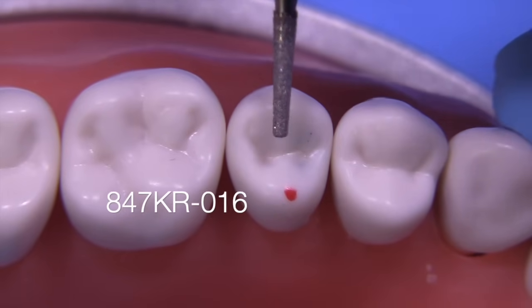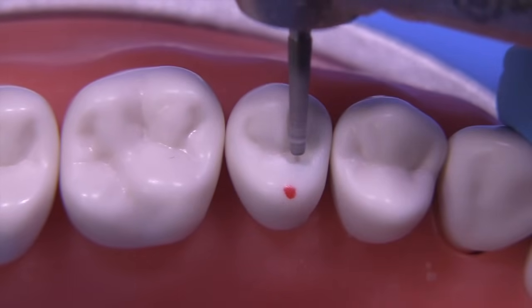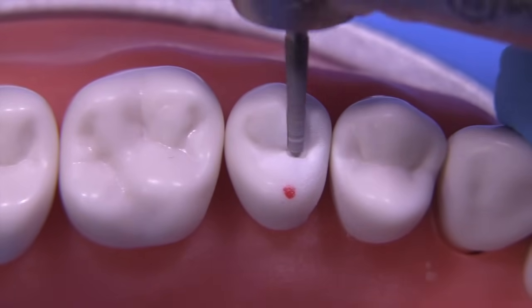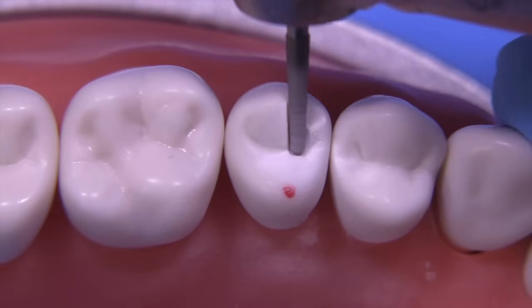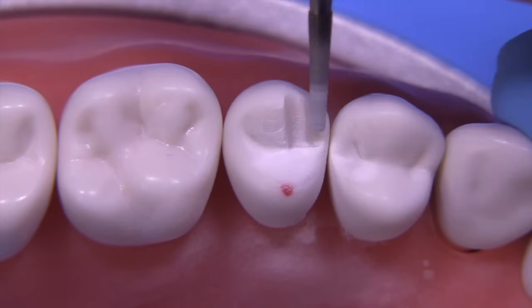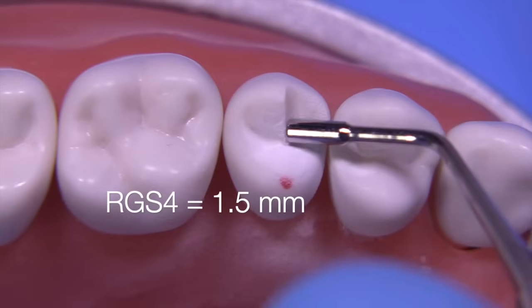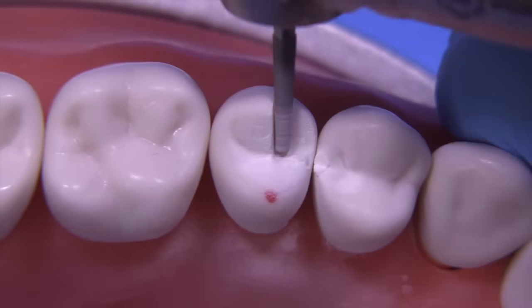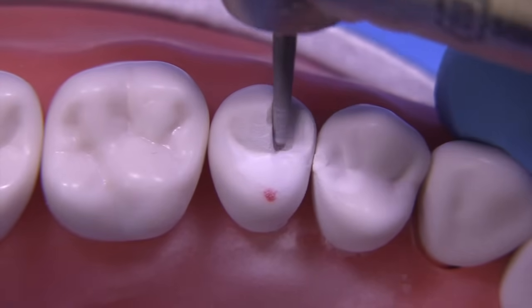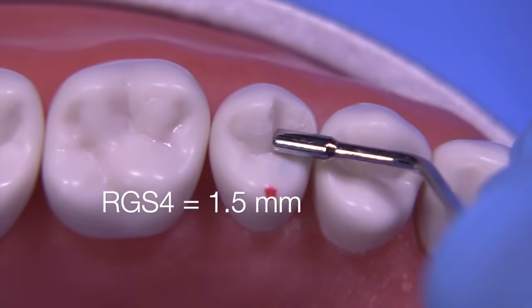We'll start with the 847 KR 016 and begin with the C-plane. I like to hold the bur parallel to the triangular ridge. The plane reduction technique utilized in previous videos is being used here again. We're measuring with the RGS4 to see if we've got 1.5 millimeters — we don't, so let's keep going. Some schools ask for two millimeters, some for 1.5, so I'm going to prep this with a range of 1.5 to 2 millimeters.